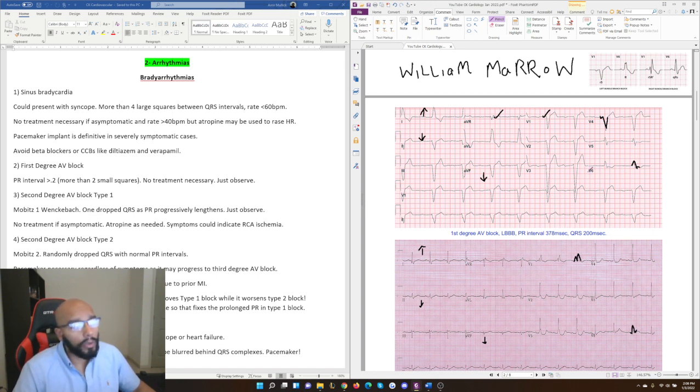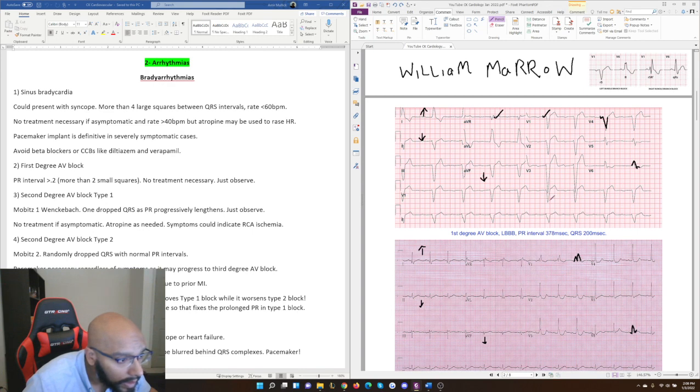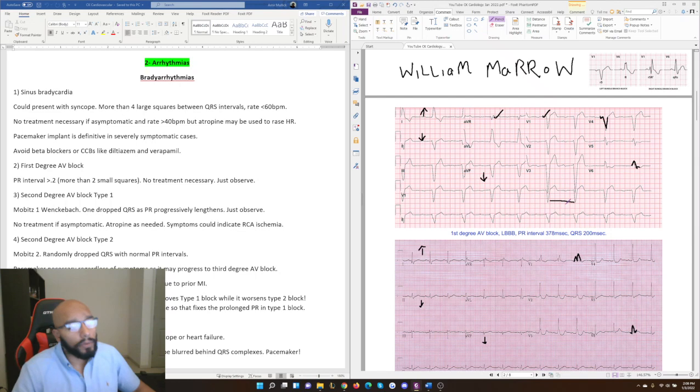So generally speaking, all we can identify now is the last thing between QRS intervals, how much space do we have, and the distance here looks like it's almost 4 to 5 boxes, right? Almost 4 to 5 boxes. So if we said that there's 5 boxes, can we see 5 boxes anywhere? Yeah, 5 boxes right here. Right, 5 boxes right there. So this is a person with some bradycardia, right? 300 divided by 5, you get 60, but sometimes we're seeing more than 5 boxes being covered. This guy is approaching some level of bradycardia as well. It's not there yet, but things are not looking so good.